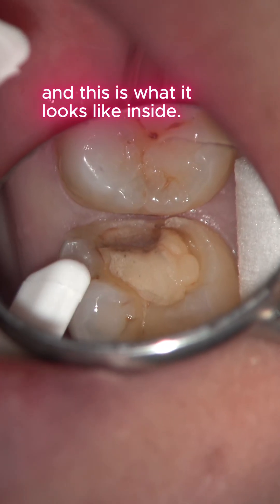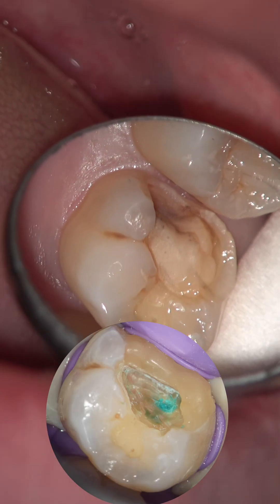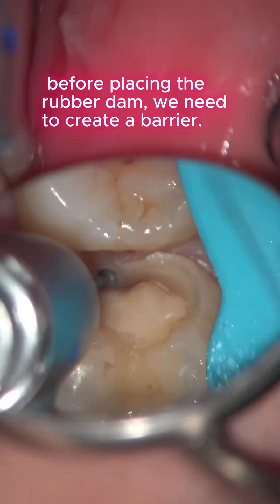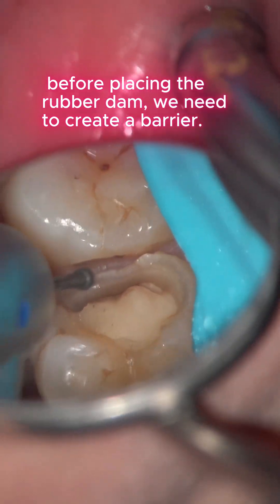There's an old filling here, and this is what it looks like inside. Now let's take a look at the treatment for this tooth. First, before placing the rubber dam, we need to create a barrier.